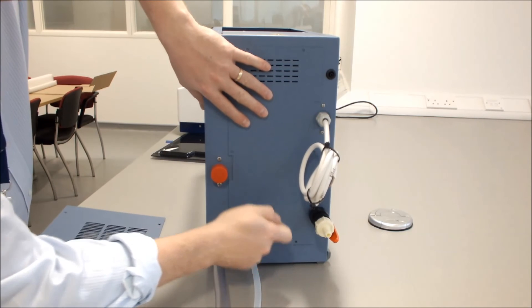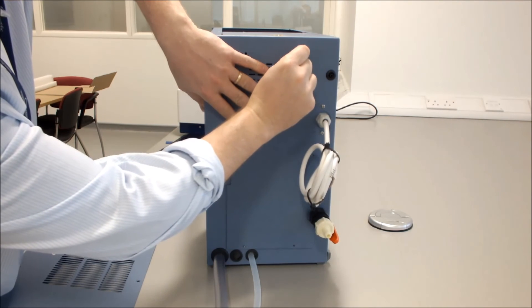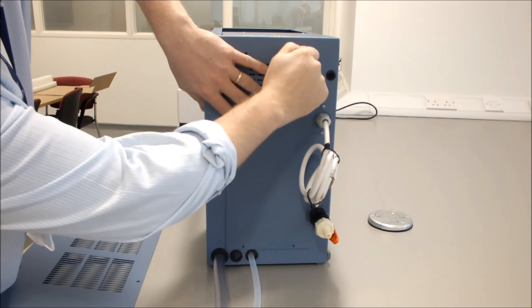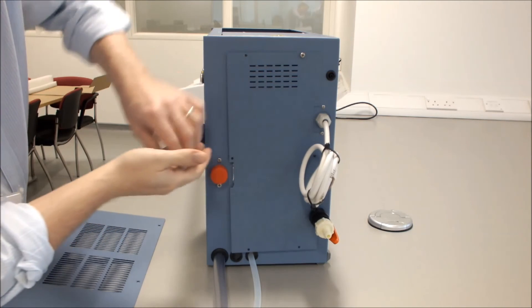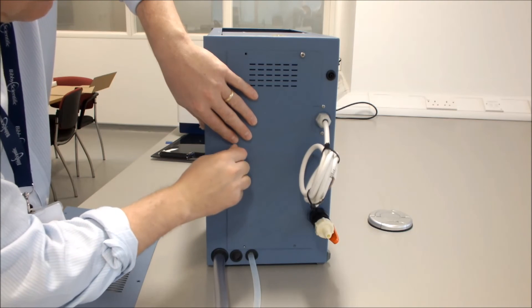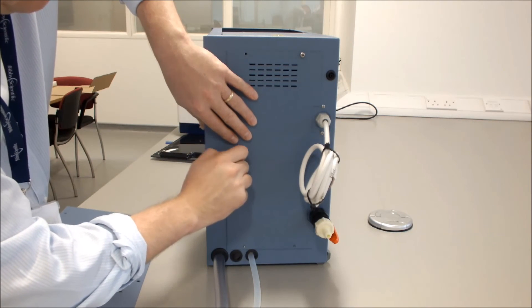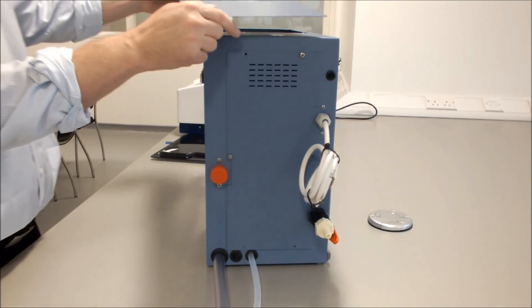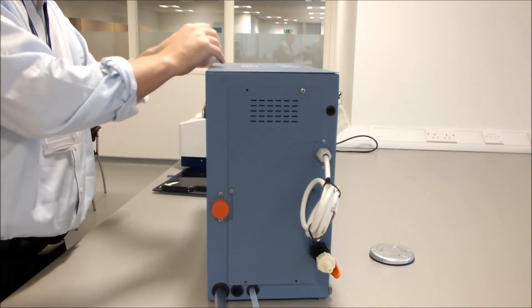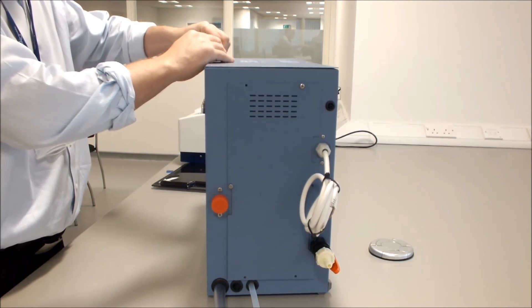Our side panel can then be connected back up using the six screws. For the purpose of this demonstration, I will only put two screws in. Our lid can also be fitted at this stage. Again, I will just put one screw in just to hold it.